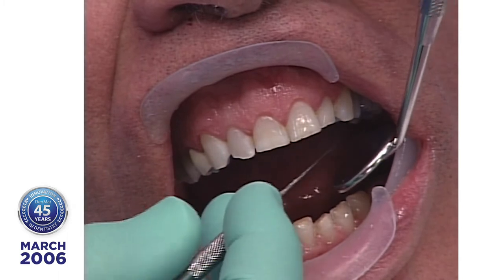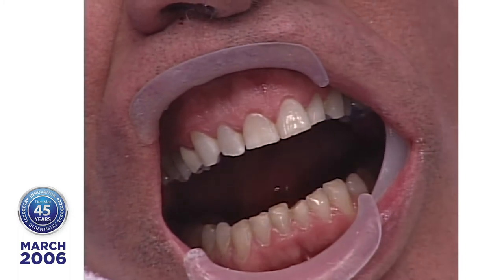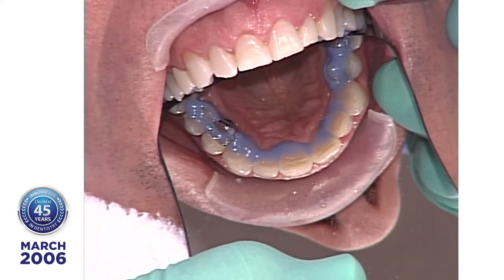This is really good. What you have to be careful about sometimes with patients with diastemas is that you don't want the blue paint on dental dam coming from the lingual side to the labial. There it is.